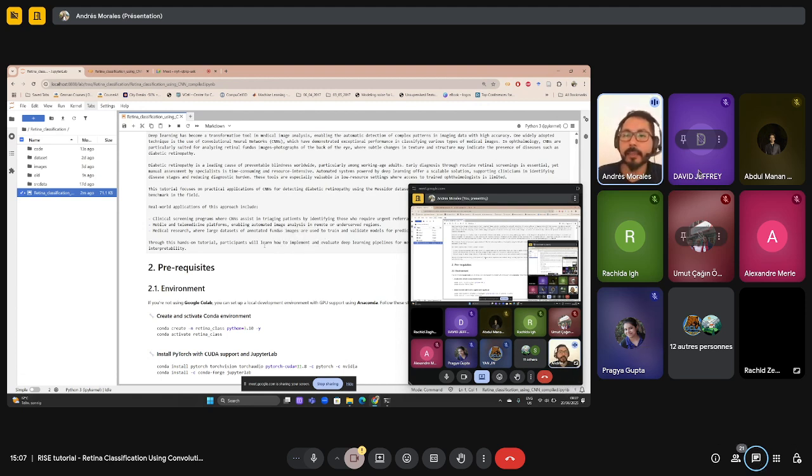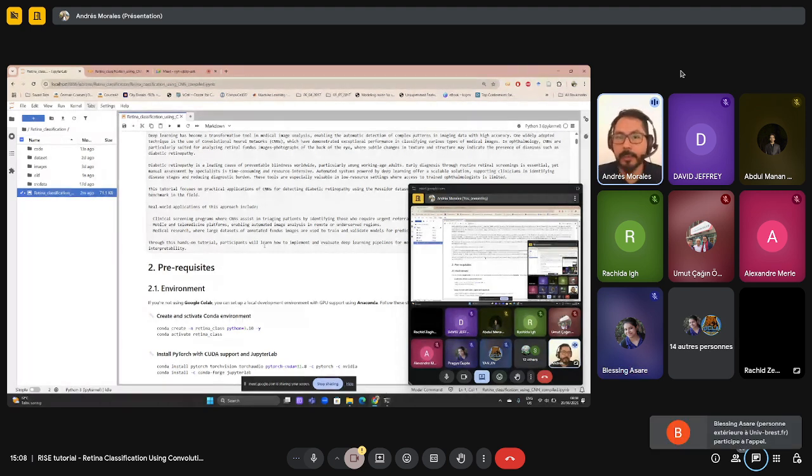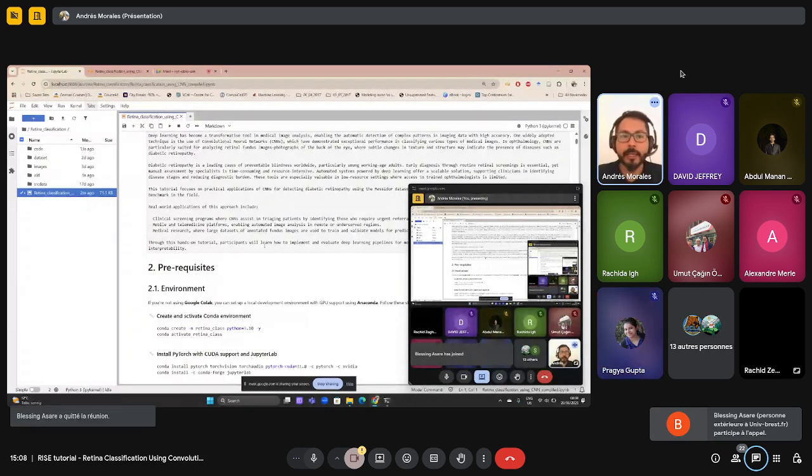So that is when deep learning comes into place, and in general, image processing and image classification tasks. The idea is to try to automate these processes in scalable solutions that will help to support clinicians to identify the disease stage, reducing the diagnosis times, and also help to understand a bit more about the disease, if we use interpretable models, as we will try to do here.